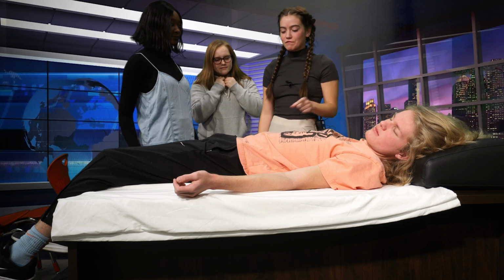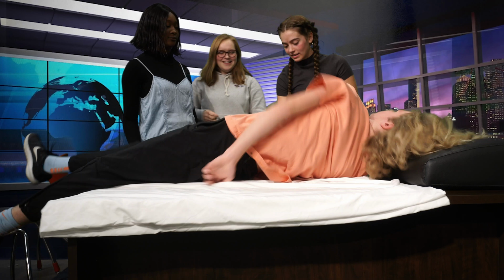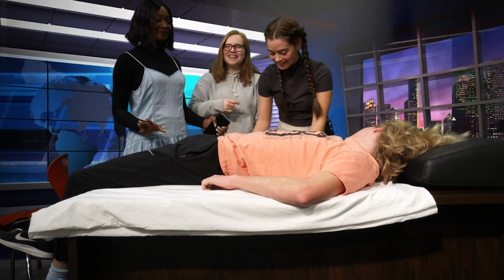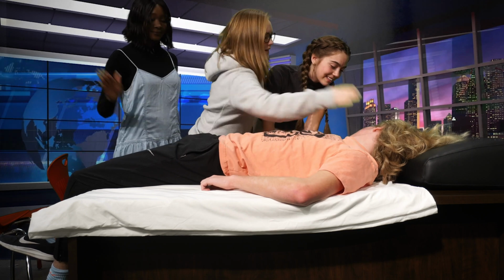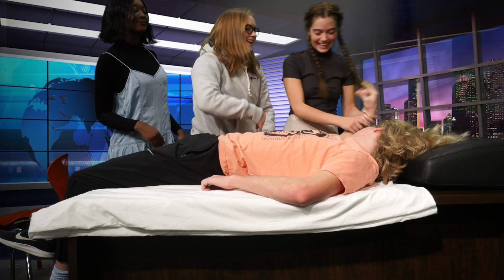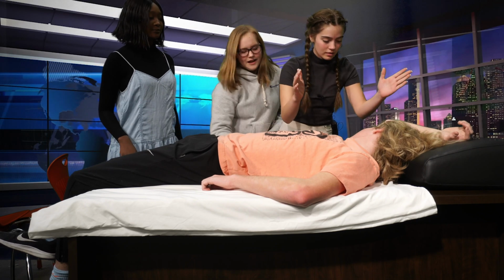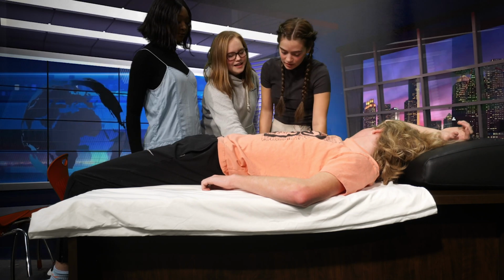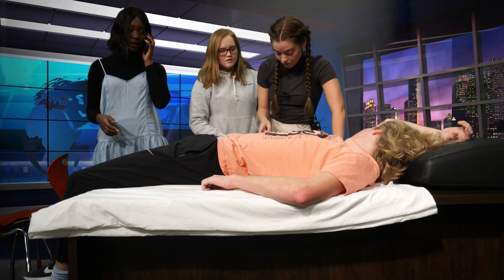First, step one, confirm cardiac arrest. We confirm it. That looks fine. Okay, step two, try to wake the person up. Wake up. Dylan! Wake up. Oh, he's dead. Okay. Gone. Step three, call 911. Rosine, call 911. Step four, start CPR.